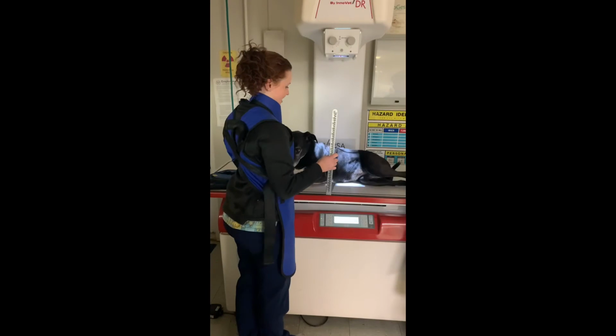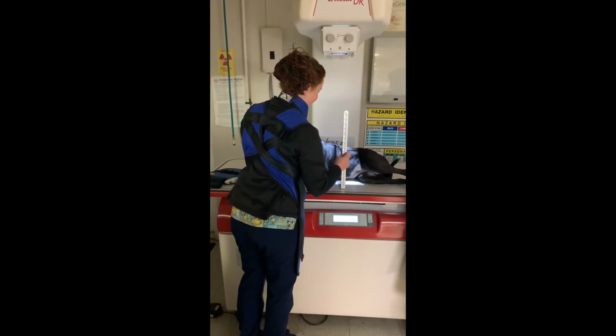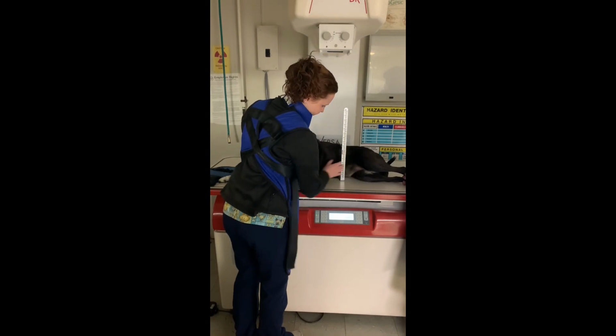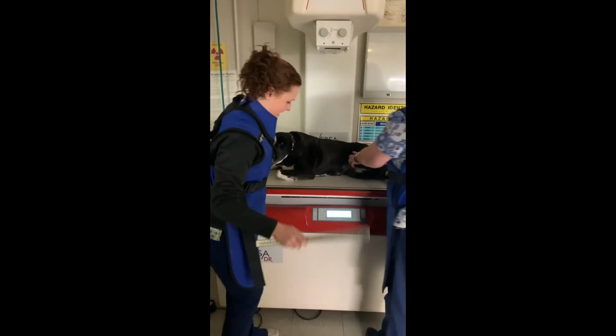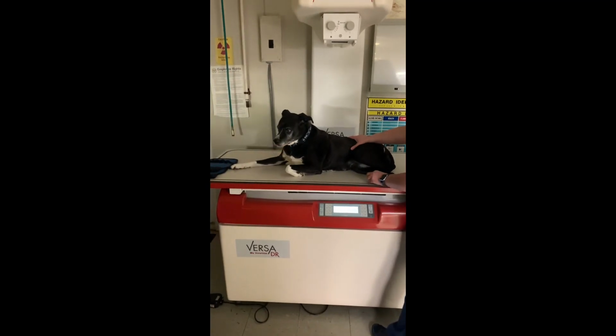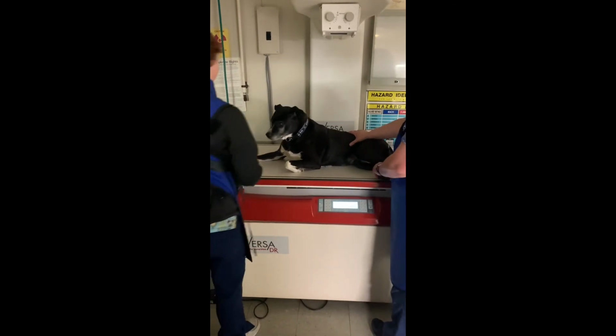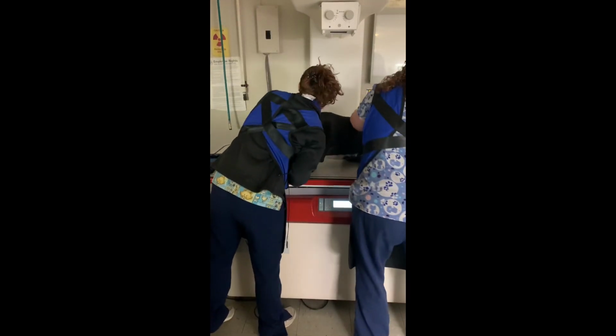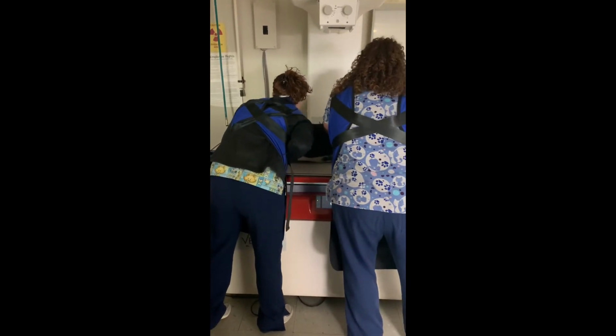Okay, for the contrast study, we're going to measure the abdomen here. So it looks like she's going to be right at 15. Measure that down. We're going to get her into position, and then we'll put on our gloves.